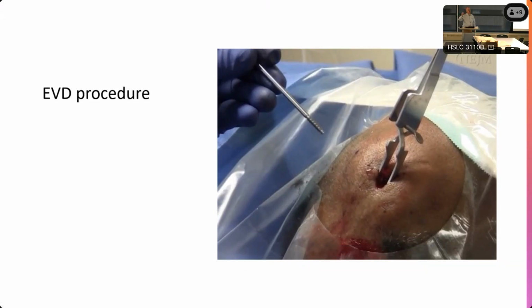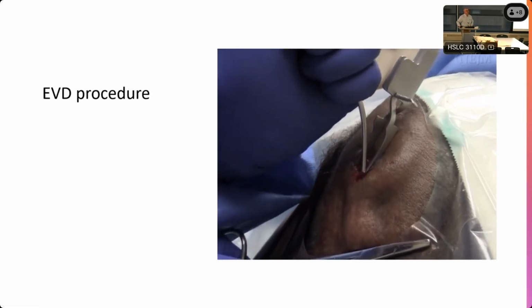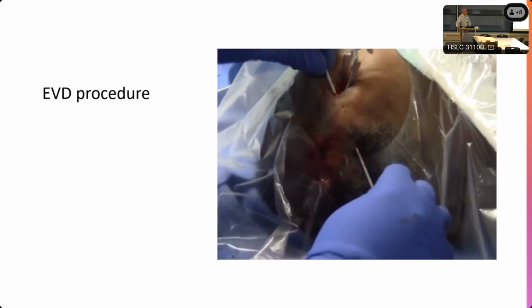Use the trocar under the inferior aspect of the incision, aiming to emerge from the skin approximately 3 to 5 centimeters lateral and posterior to the incision. Reconnect the protective cap to the sharp end of the trocar.